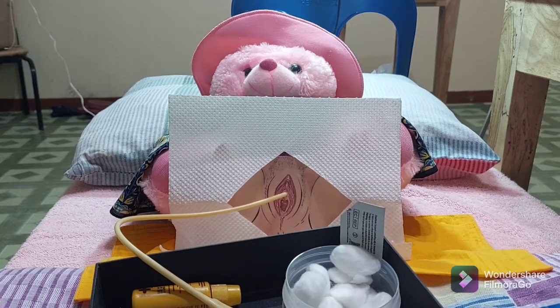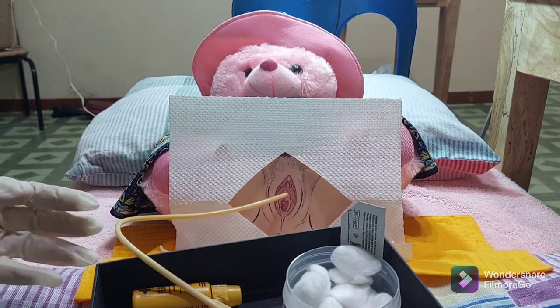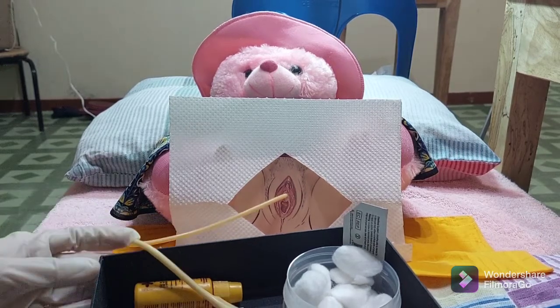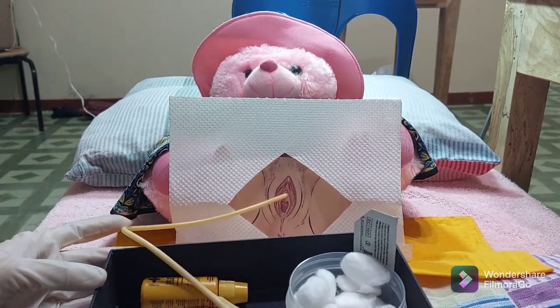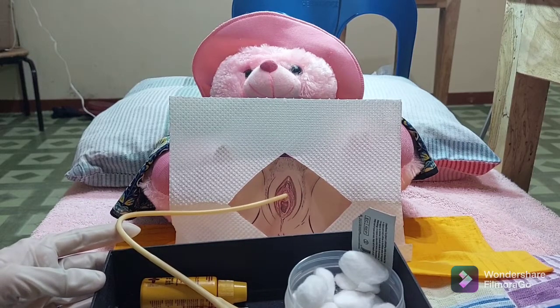Place the catheter in the sterile tray and collect a urine specimen if required, because a urine specimen may be required for analysis. Collect as per agency policy.